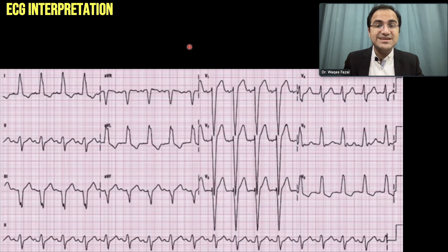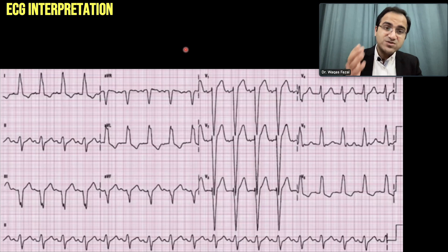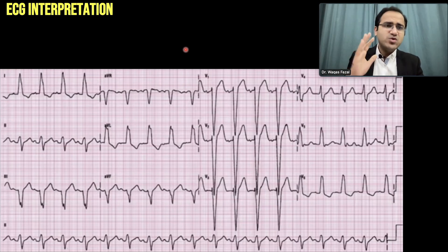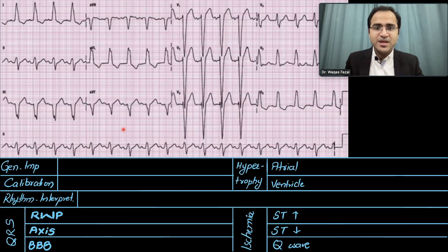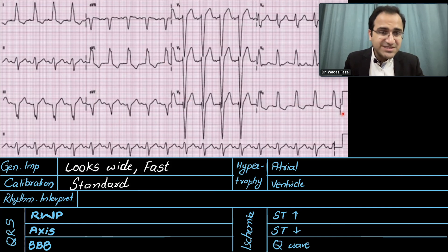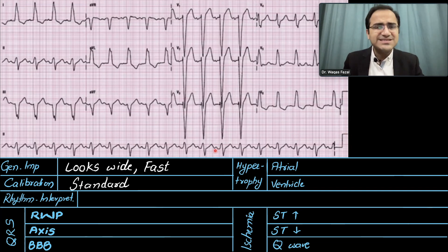Now coming to the second ECG. You should pause the video and try to solve it yourself before continuing. The general impression is that the ECG looks fast and there are wide QRS complexes — it looks wide and fast. Looking at the calibration: since the calibration marker has been cut off we cannot see the box, so we label it as standard calibration.